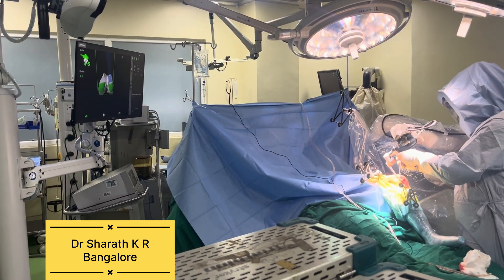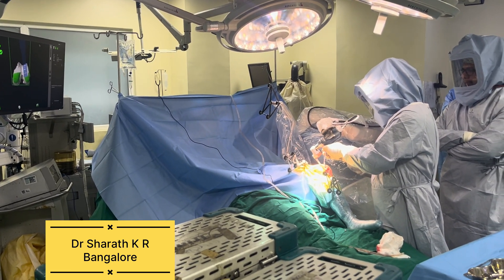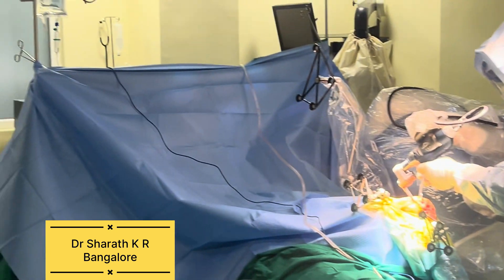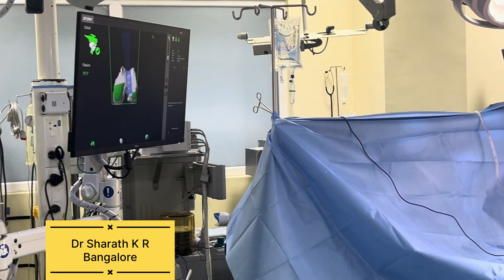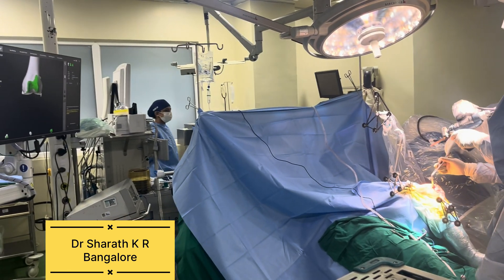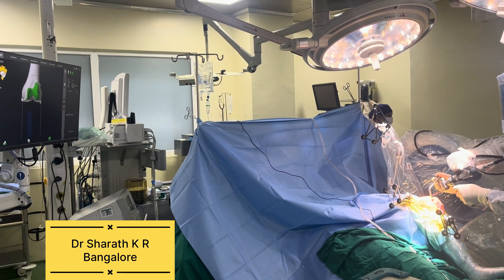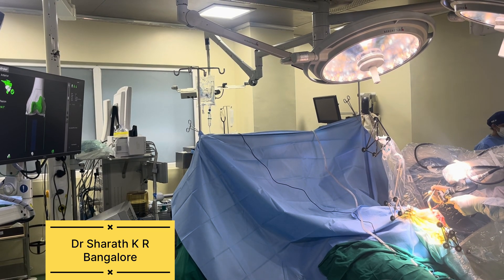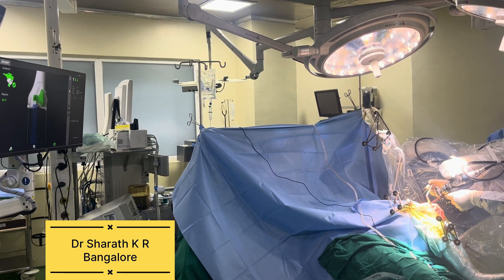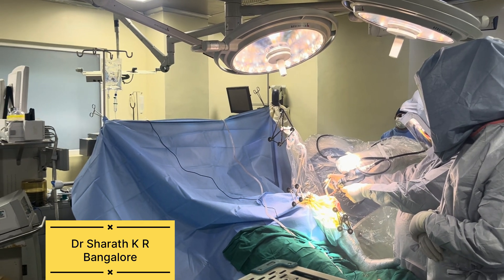This robotic arm, as I mentioned, is semi-automated, meaning the surgeon himself will be doing this procedure along with the robotic arm in his hand — the robotic arm will be doing the resection on the area which is marked. Because of haptic control in the robotic arm, the arm will not go outside the area marked on the monitor. This confirms that it will not cut or damage any other structures which are not marked on the monitor.